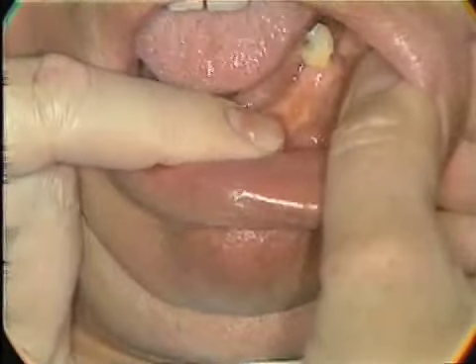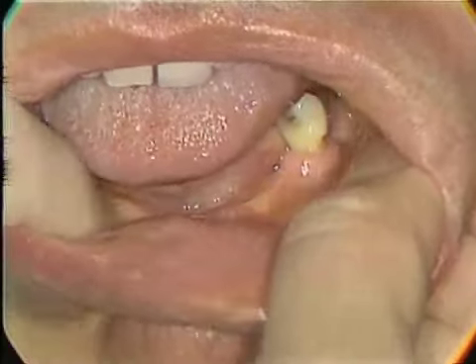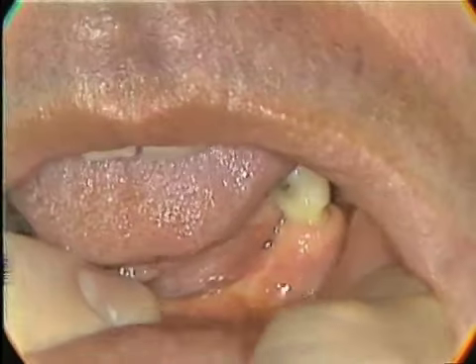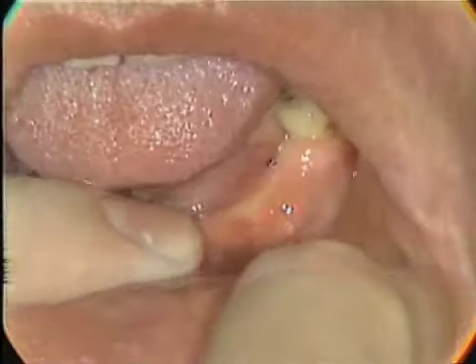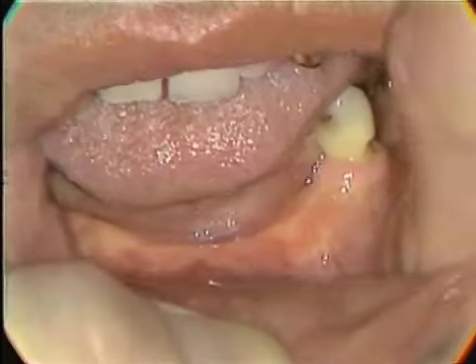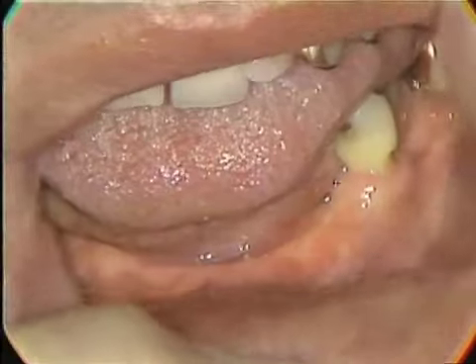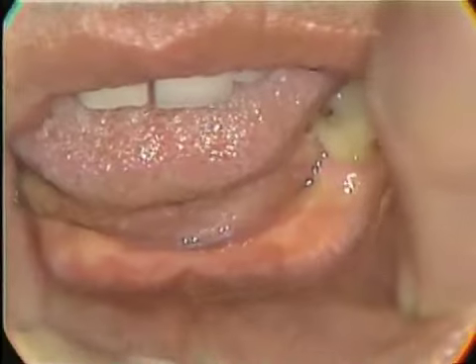Now, if we look more closely at what we can do with this peripheral tissue when we manipulate it, notice this peripheral edge along here. Let's see what happens to that as I manipulate the tissues. Put your head down a little bit, please. As I manipulate the peripheral tissues, we can see that tissue going up and down. Where would we want the peripheral tissues? Well, we'd want those at rest because we can't duplicate this tugging position or pulling position.